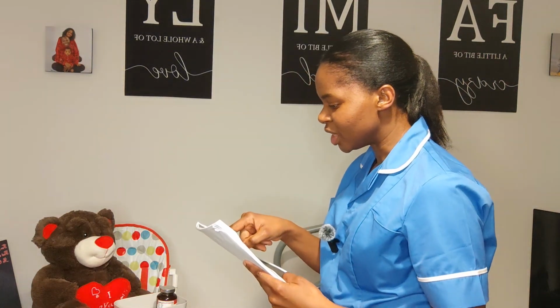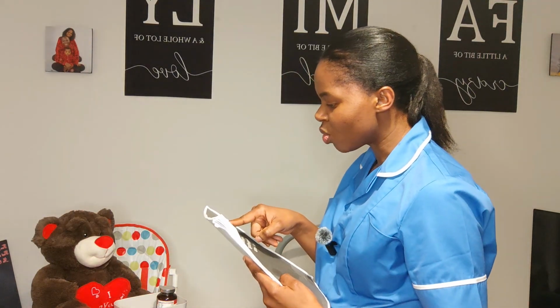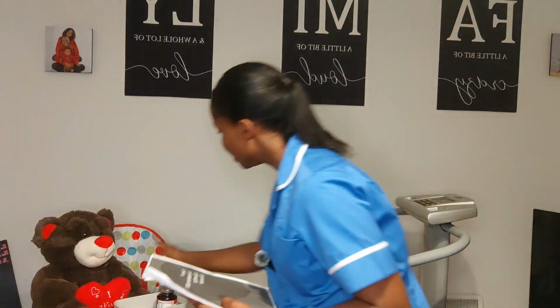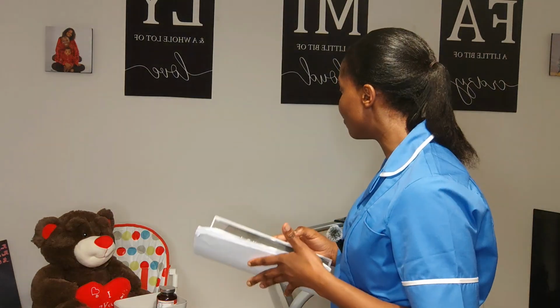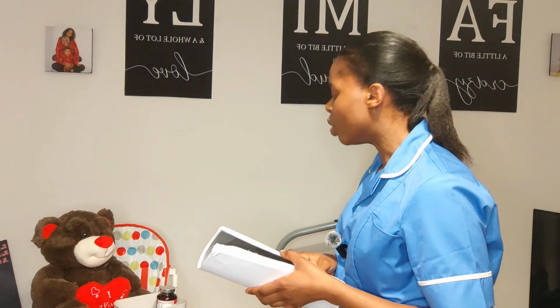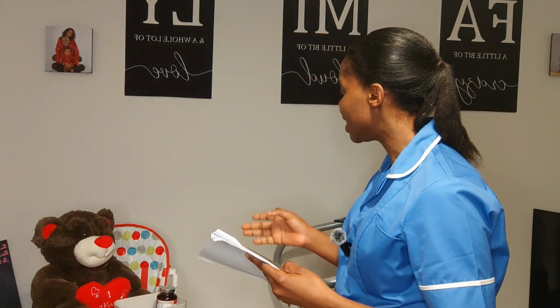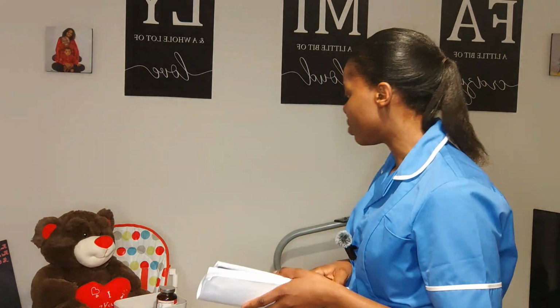All right, so I have here Janet James. Your date of birth is 0101-1992. Your hospital number is 1234567. Fantastic. Assessor, I can confirm I am with the right patient. Do you have any allergies at all? Okay, bless you. There is no allergy, or it is properly documented in my notes that you have no known allergy, and that is why you are not on a red wristband. Okay, how may I address you, please? All right, Janet is fine.